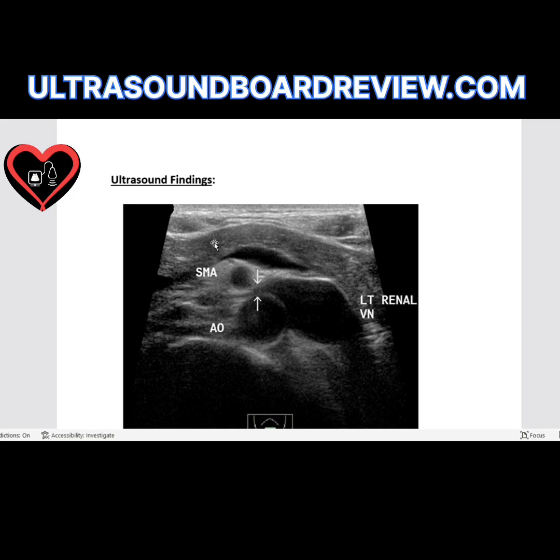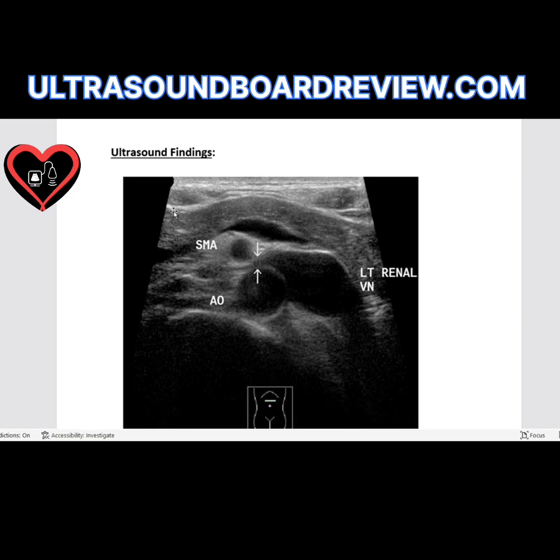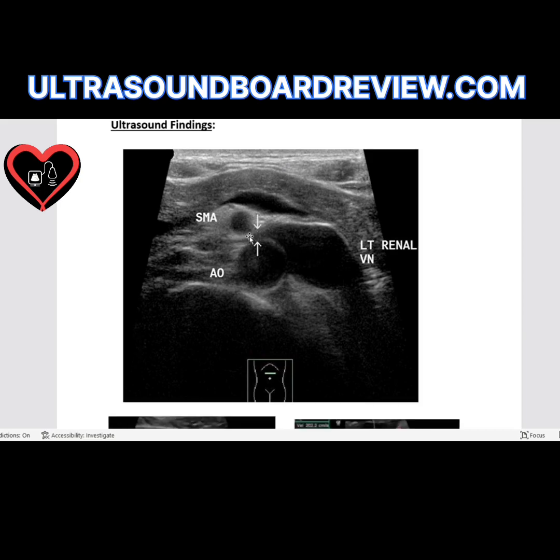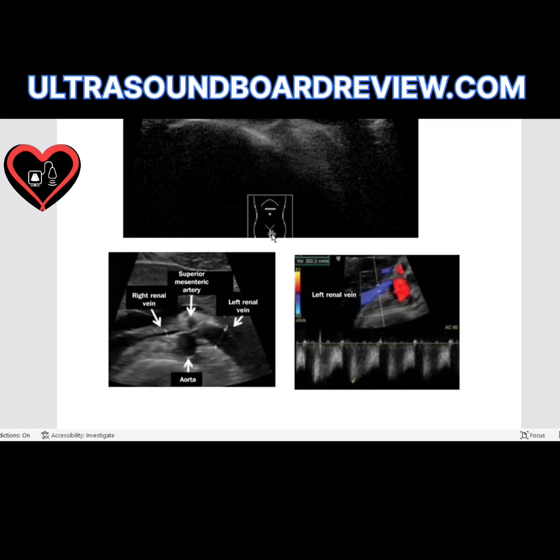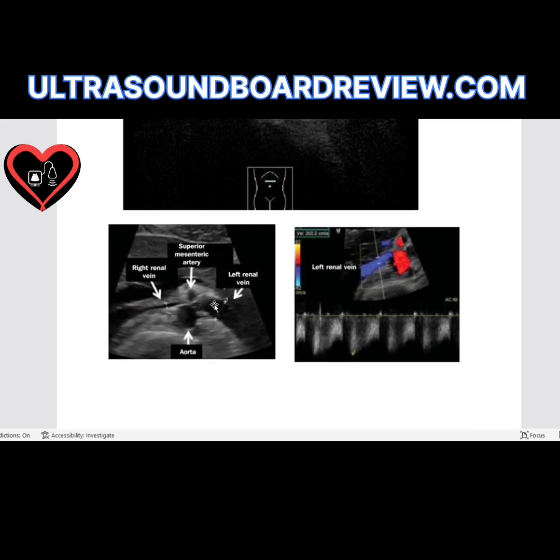On ultrasound, we're viewing a transverse view with the index pointing toward the patient's right side, showing the head, neck, body, and tail of the pancreas. Just below, we have the superior mesenteric artery and the aorta. You can see the left renal vein is compressed in this image and then dilates. In another transverse view of the pancreas, you can see the SMA and aorta compressing the renal vein, with the left renal vein visibly dilated.